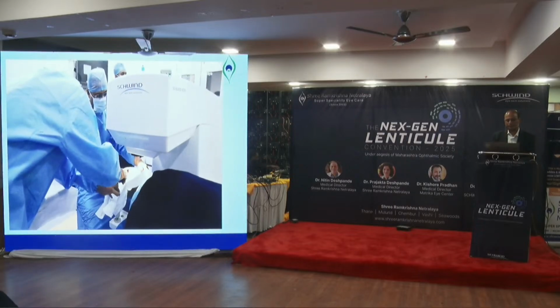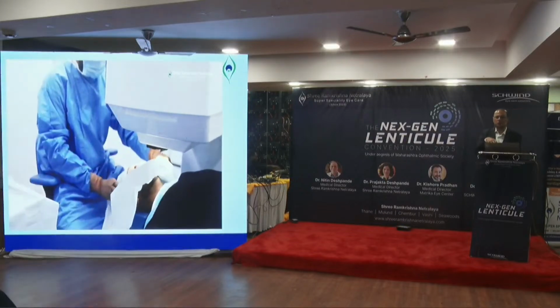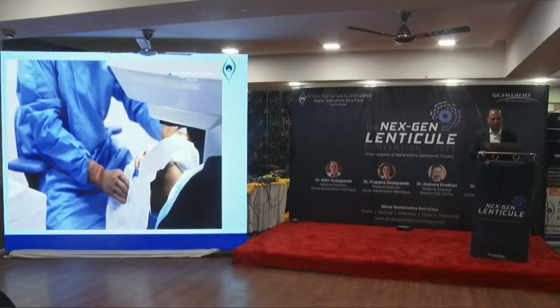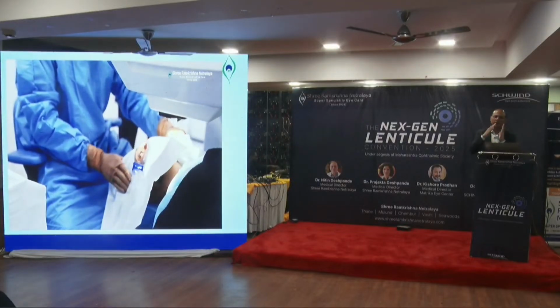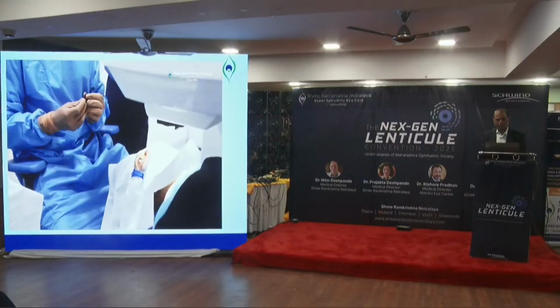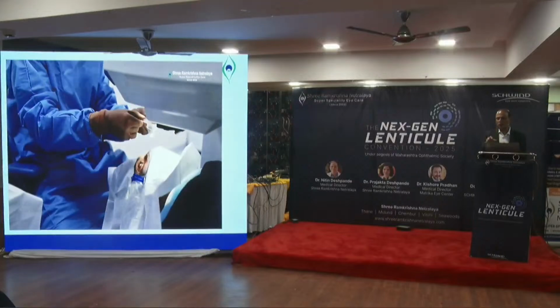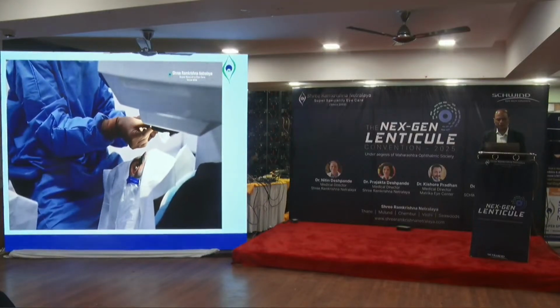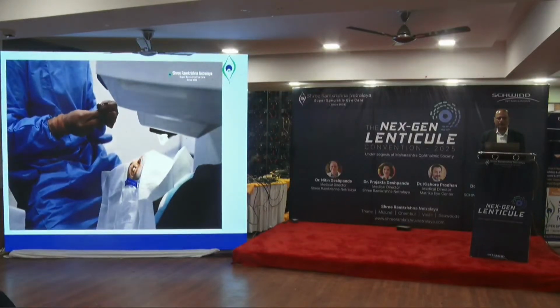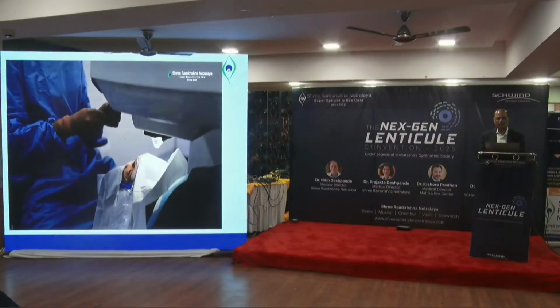Chin up. So you position so that your cup doesn't hit the nasal bridge. Few people have very long nose, so you have to little tilt the patient's head away. It's a very elegantly designed cone, and it goes and sits on the cornea very well. So you just click and it's ready. The machine laser immediately calibrates once you click that PI in.